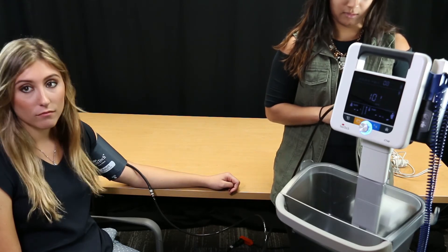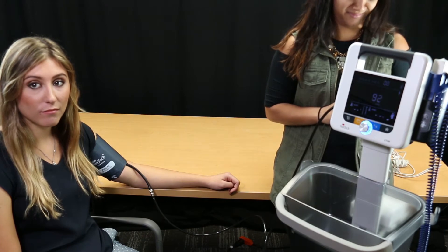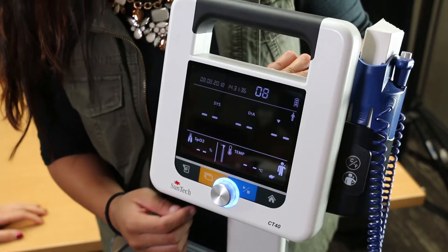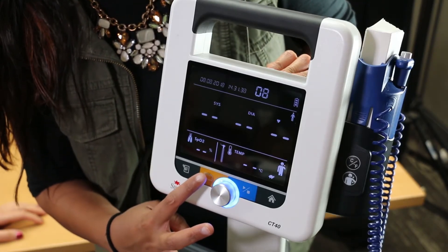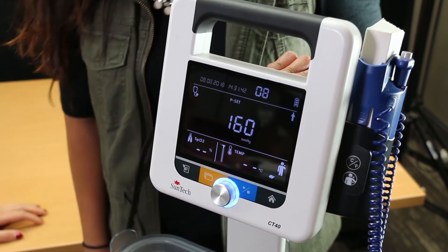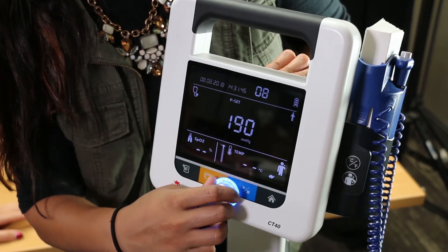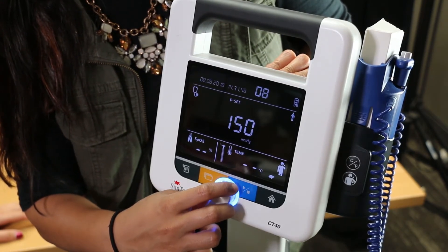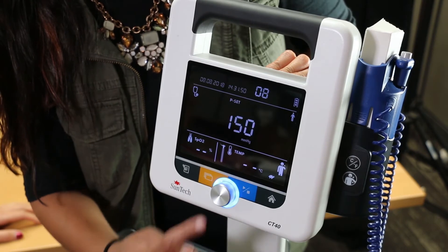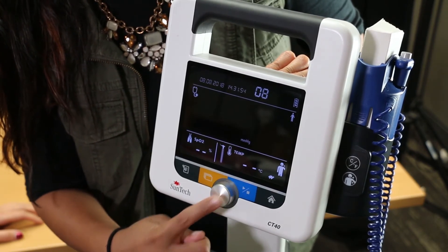To switch to manual mode, press the mode toggle button until you see the auscultatory sphyg mode icon. Next, choose a maximum pressure value — the pressure setting icon and selection knob will flash. Use the knob to set the desired pressure level between 100 and 280 millimetres of mercury. The device will remember the pressure setting and display the same pressure setting the next time sphyg mode is used.